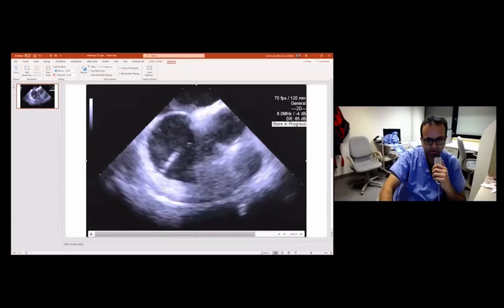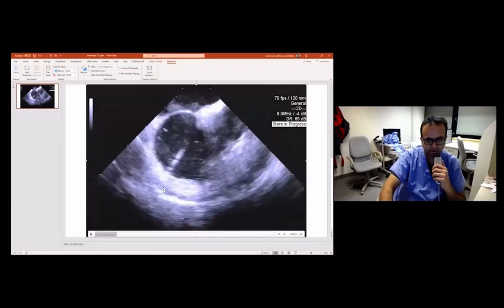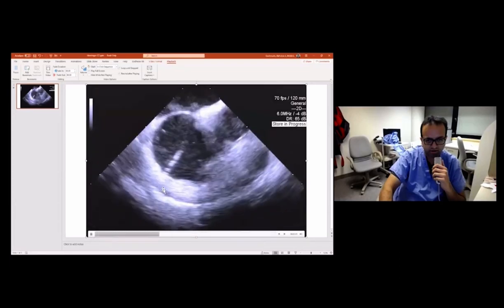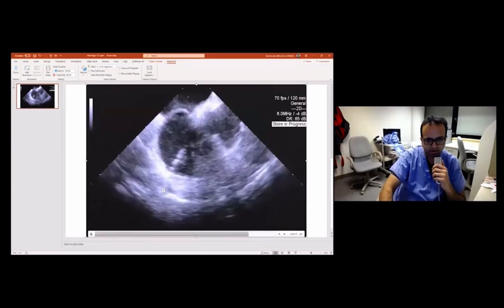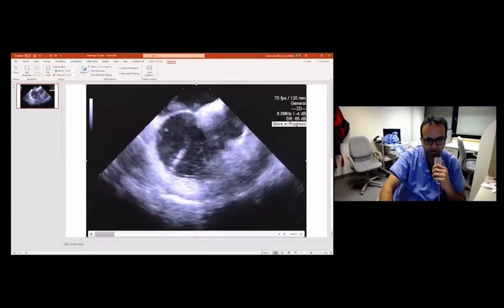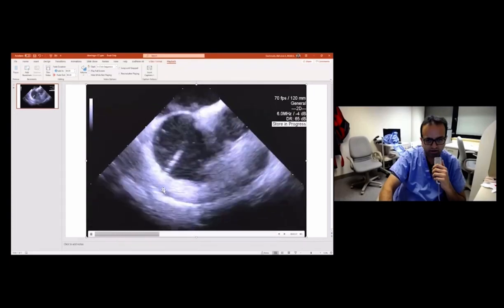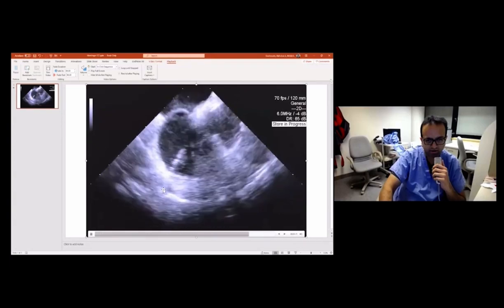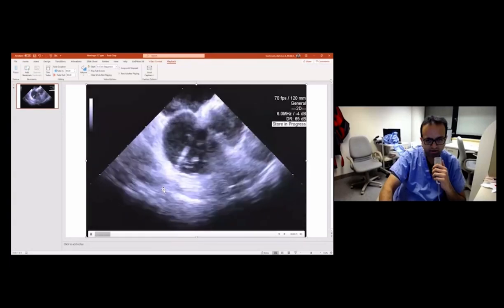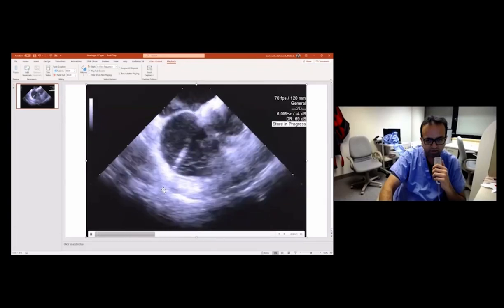A couple of things to remember here, we can certainly injure a lot of things in the coronary sinus. Coronary arteries become the major concern. But as long as your catheter in RAO view is looking more atrially and you have a big atrial electrogram, I think that could be somewhat of a safety net.